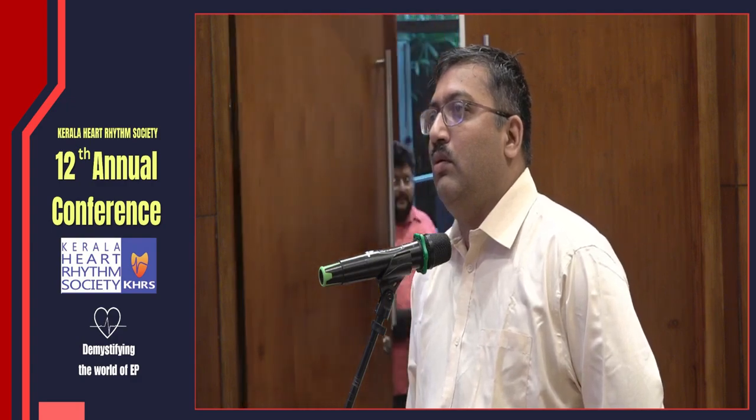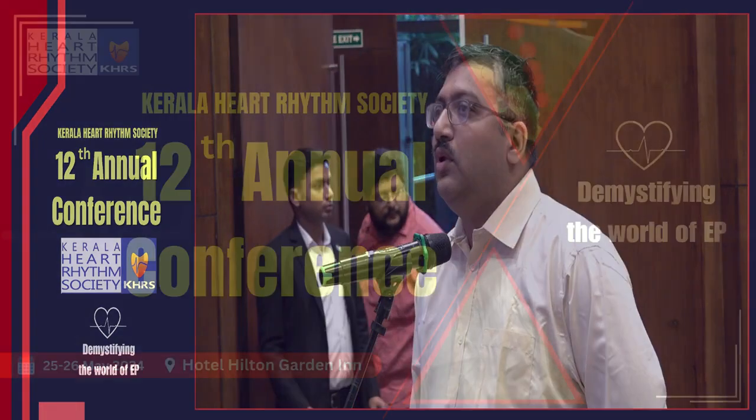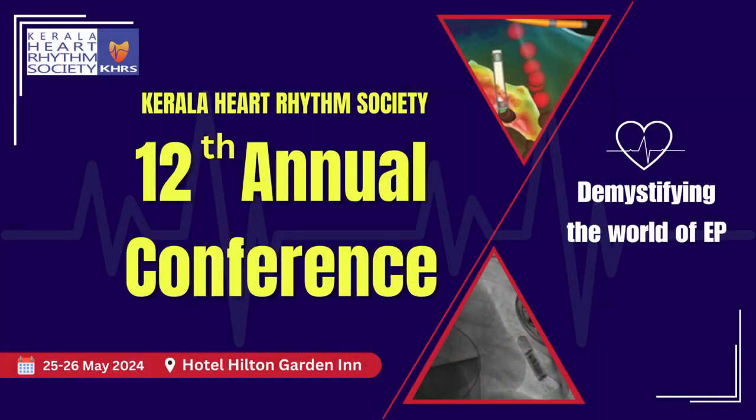How do you base it on an absolute value of LVAT? No, you should not take any absolute value; rather, you have to go by a short and constant number. Because if you are in the upper septum, the basal septum, capturing the main bundle, then that number of 75 and 85 will hold good. But when you come down, you can even see an LVAT of 45, but with a QRS duration of 130, 140 milliseconds. So it depends on the position of the lead in the conduction system.